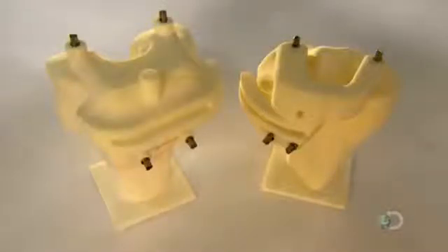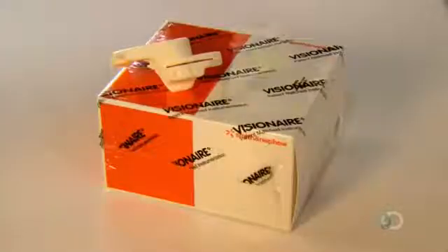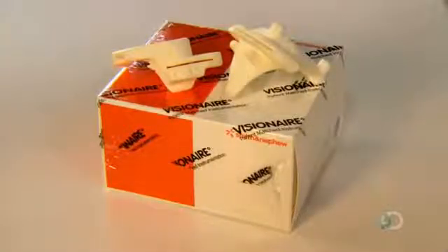This method eliminates several steps required in standard surgery. Therefore, the operation takes less time and requires half as many instruments to set up and clean up. And because the surgeon no longer has to drill a hole in the bone to check the knee implant's alignment, the patient experiences less pain and bleeding, which means less likelihood of developing complications such as blood clots.